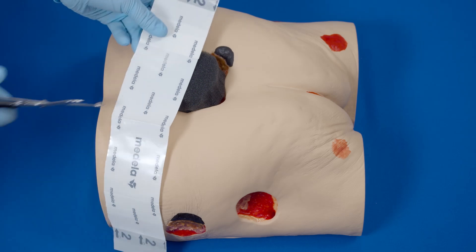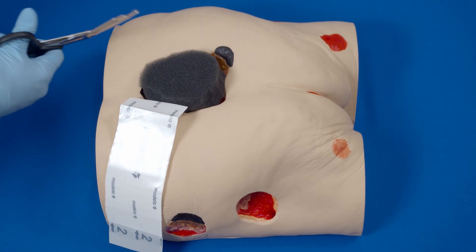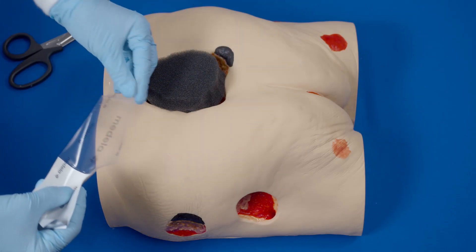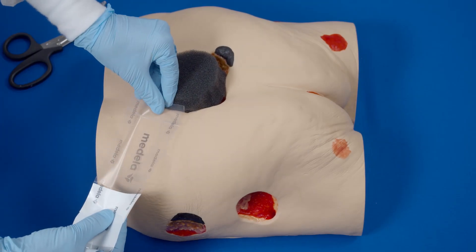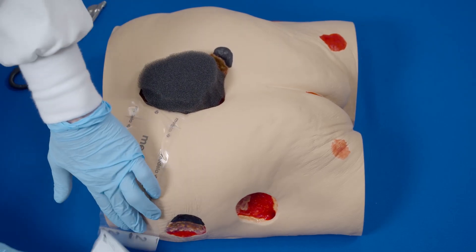Apply transparent film over any intact skin between the wound and the relocation site. Partially peel back one side of layer one and place the adhesive side down, then remove the remaining side of layer one.